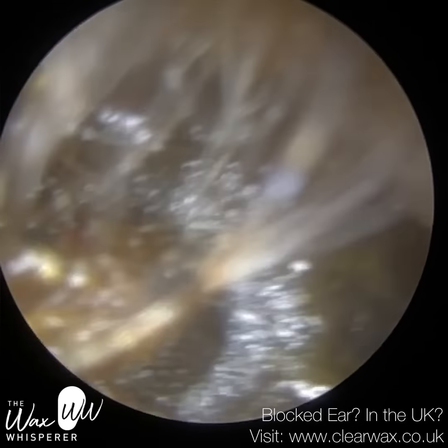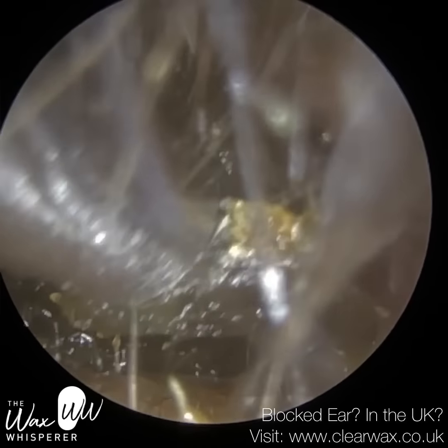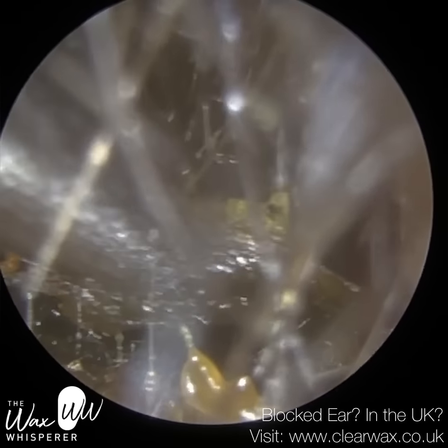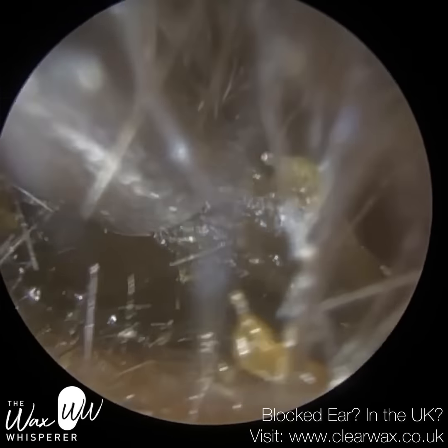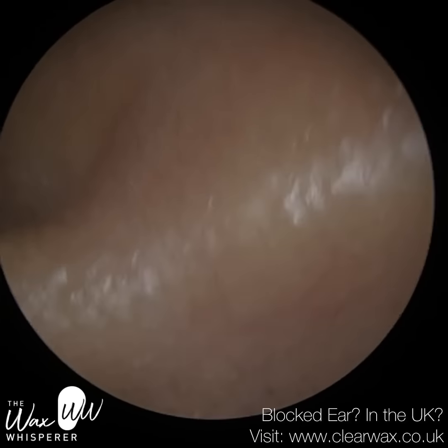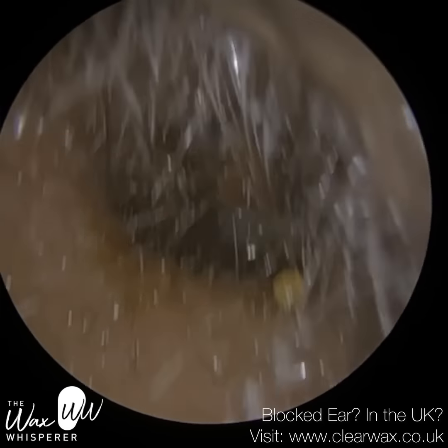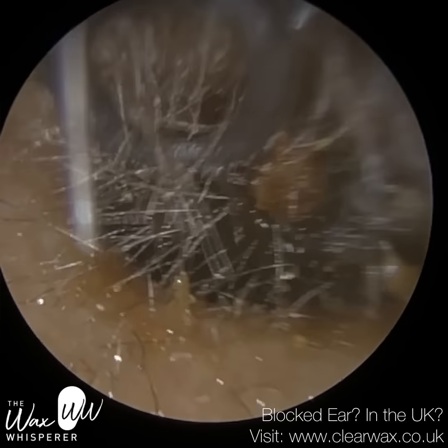This patient's entrance of the ear canal is quite hairy as you can see, but they're not causing me a problem, so for that reason we're not going to trim them or pluck them away. It's only very seldom that I've had to remove hairs, and that's when there's absolutely no visibility in the ear. This is a medical healthcare procedure, so as long as it's not affecting my work we leave well alone.